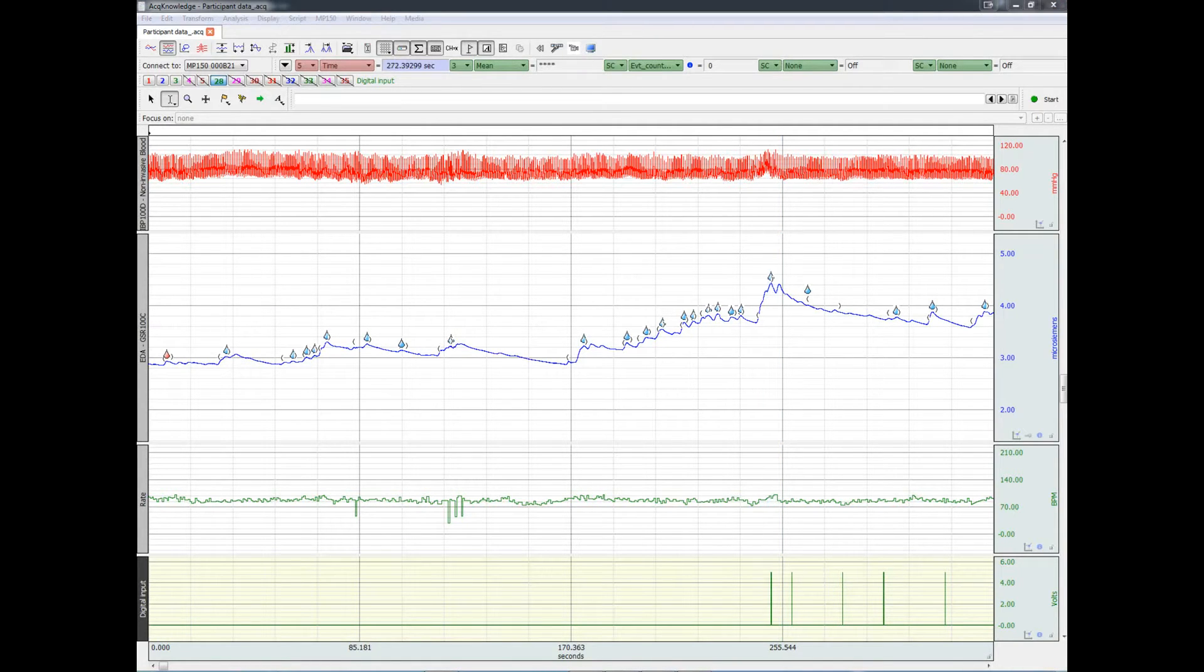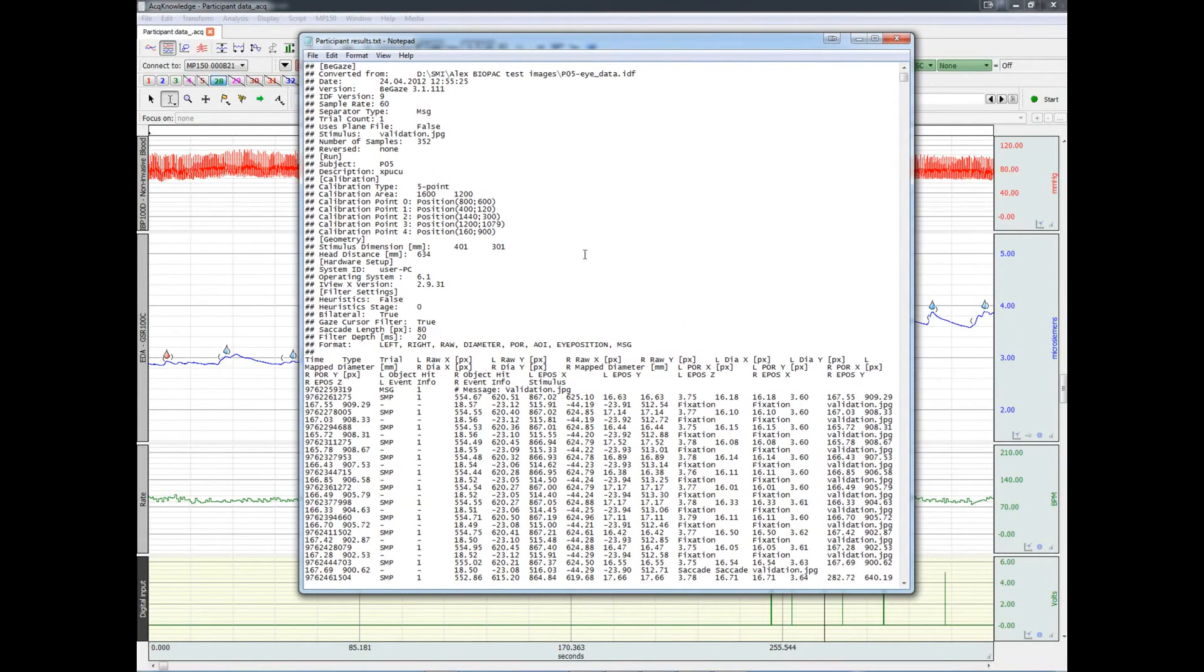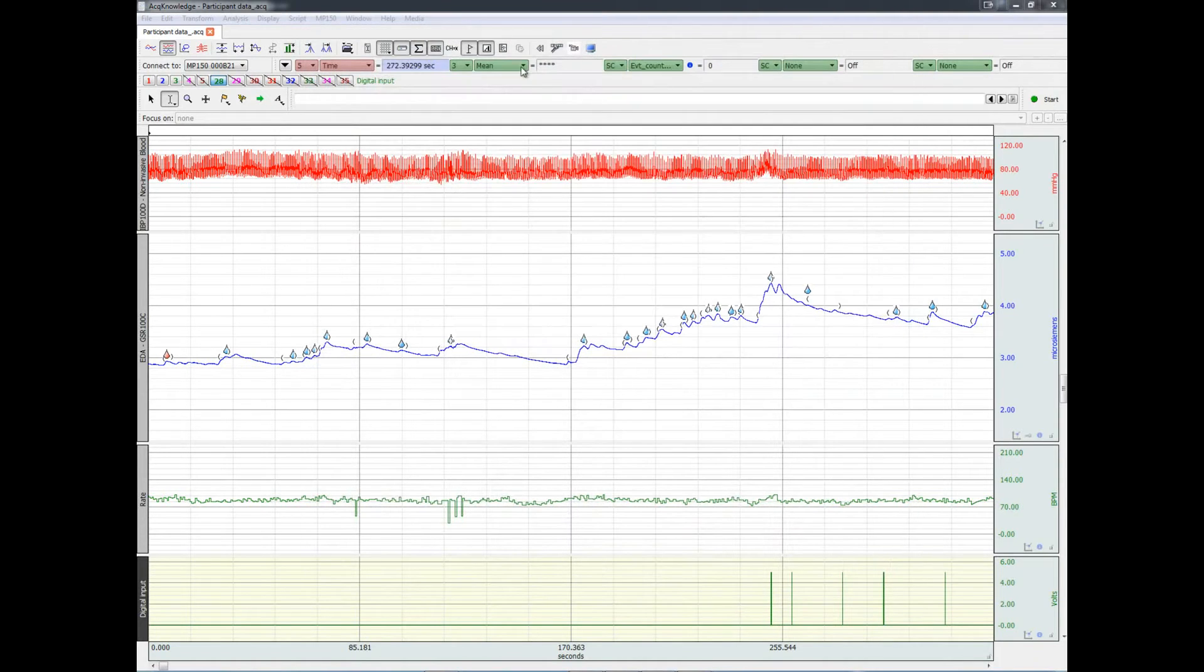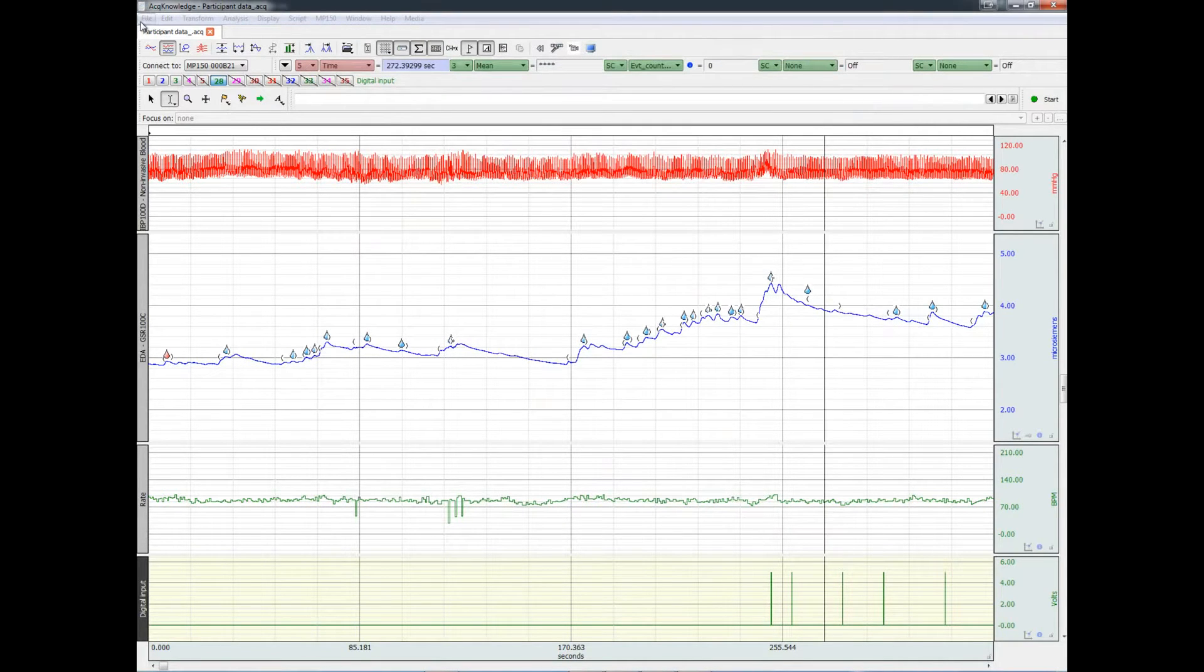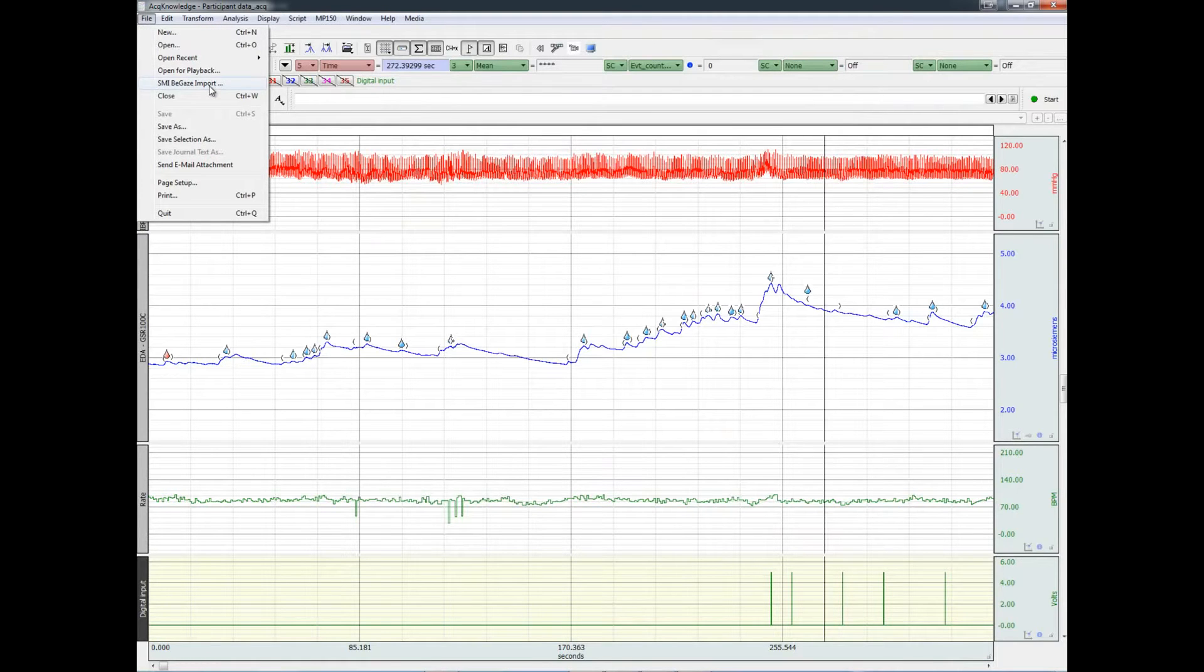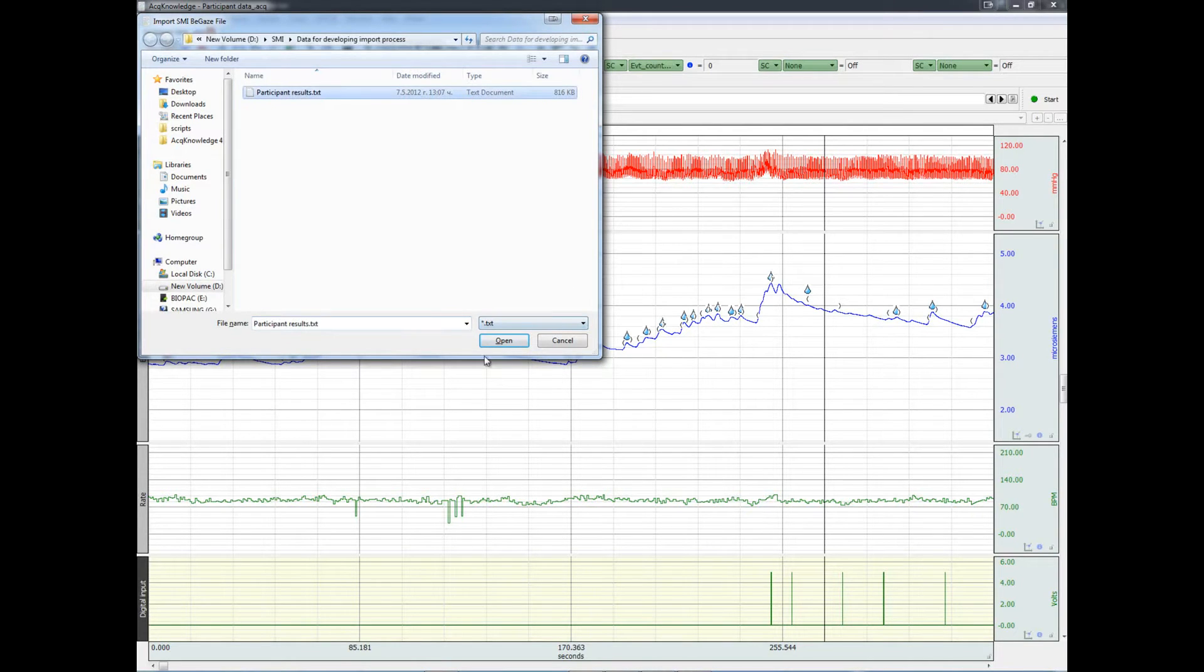The eye tracking data has been exported from BeGaze as a text file. We can now merge this eye tracking data into the physiological record. Go to the file menu and choose the SMI BeGaze import. Choose the file that contains the exported data from SMI.